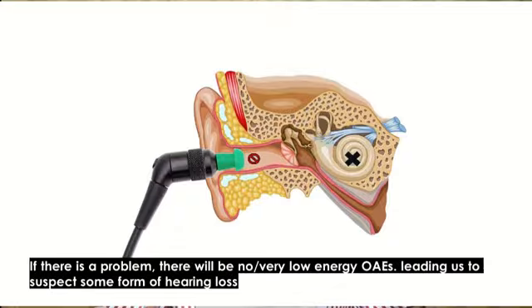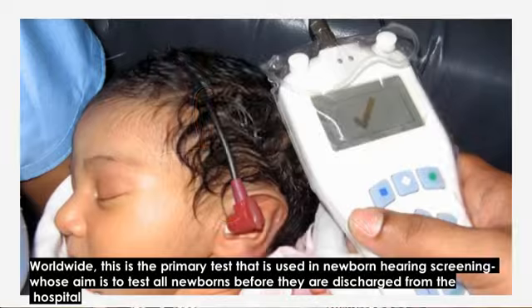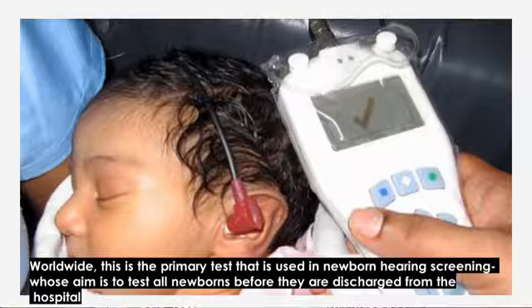If there is a problem, there will be no or very low energy otoacoustic emissions, leading us to suspect that there is some form of hearing loss. Worldwide, this is the primary test that is used in newborn hearing screening, whose aim is to test all newborns before they are discharged from the hospital.